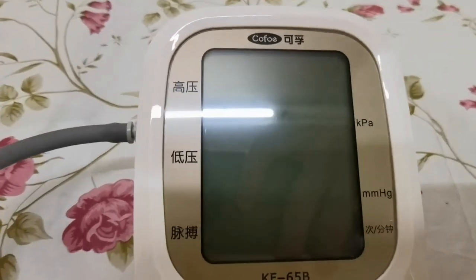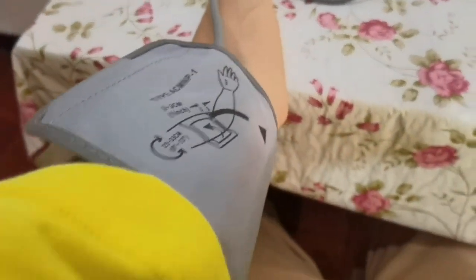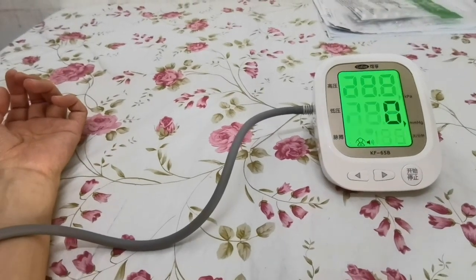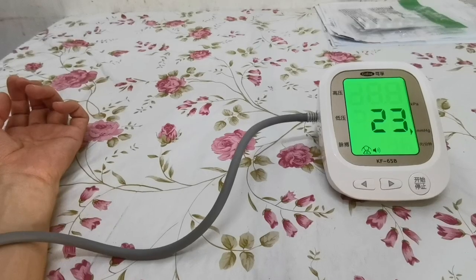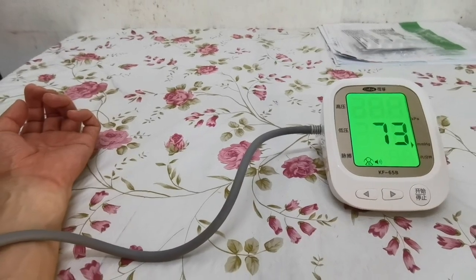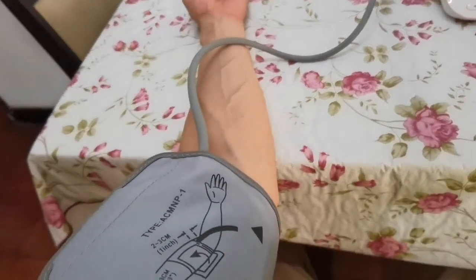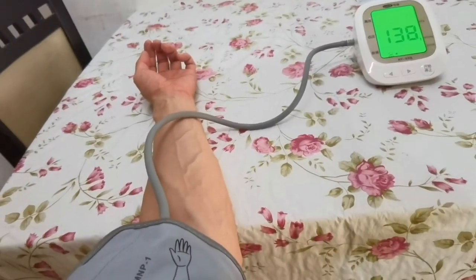This is a Chinese blood pressure monitor — I bought it on Taobao. I threw away my previous one, a Japanese-made national brand that my father bought, which I tossed in the rubbish bin.